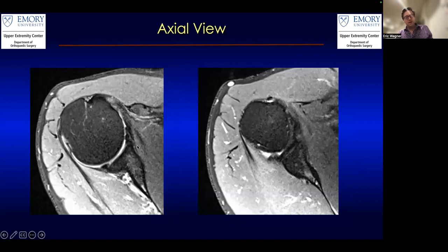This is another example. So once again, your subscapularis, your infraspinatus on this side, infraspinatus here, subscapularis, your biceps tendon, the joint. You can look at the joint for little subchondral cysts if you're looking at arthritis. If you're looking at instability, once again, here's your labrum connected to the capsule here, connected to the capsule there. Your deltoid muscles are out here. This is your conjoint tendon coming down.